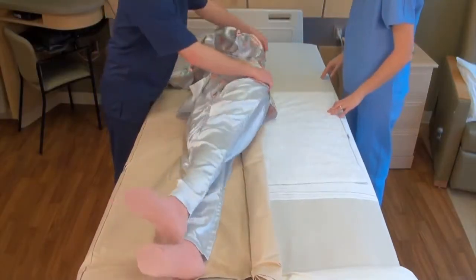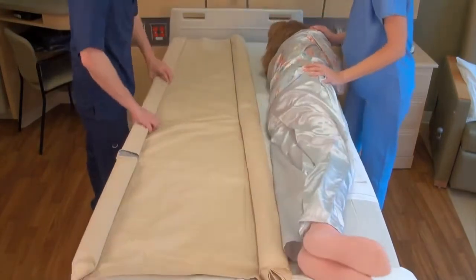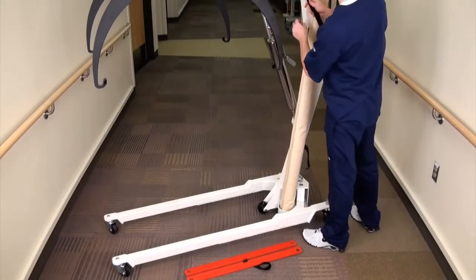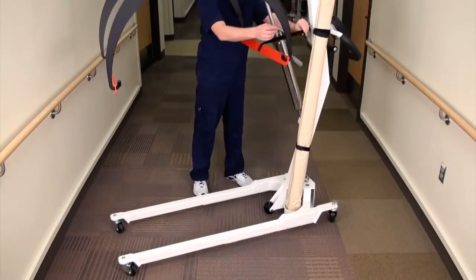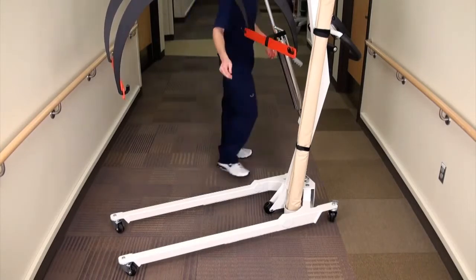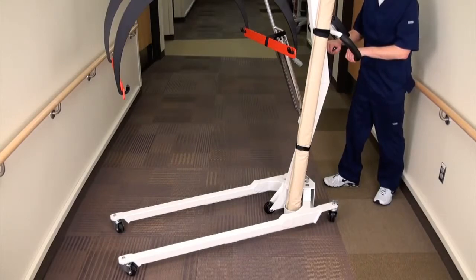To remove the stretcher from underneath the patient, follow the same steps as before by rolling them first to one side and then the other. Replace the stretcher into the stretcher cup and using the Velcro straps fasten it to the column. Place the transport bars back onto the support hoops and secure the bar closest to the column using its Velcro strap. The Detecto in-bed scale is ready for transport to the next patient's room for new weighing.